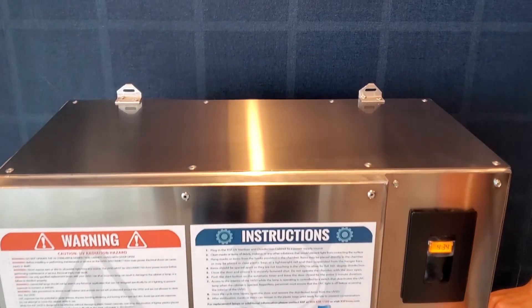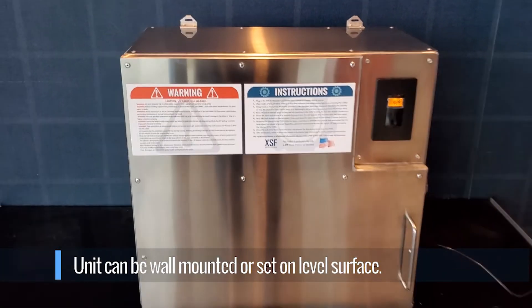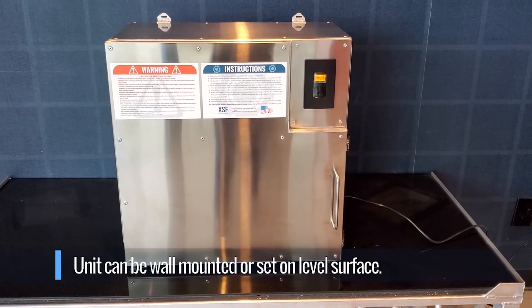The XSF UVSD04 cabinet is equipped with two top brackets for wall mounting, or the unit can be set on a solid level surface.